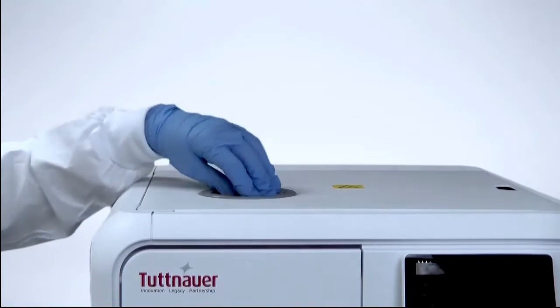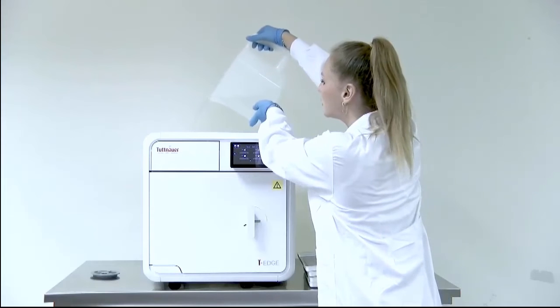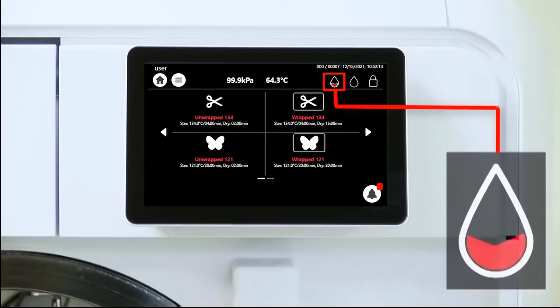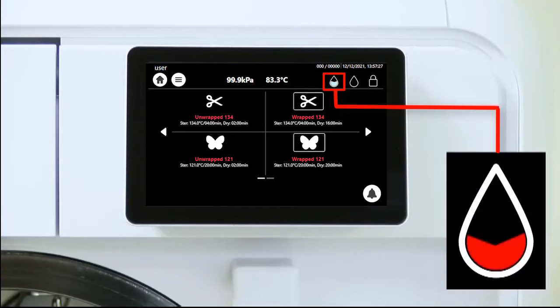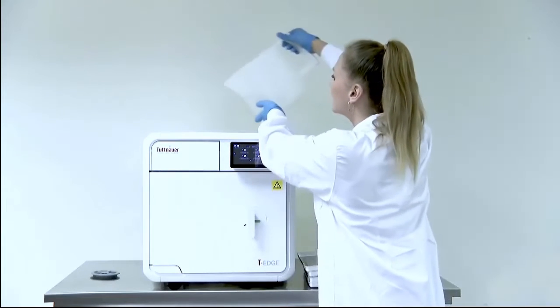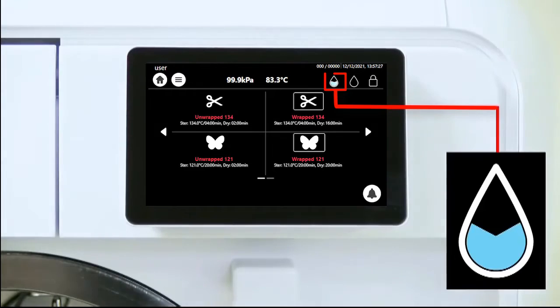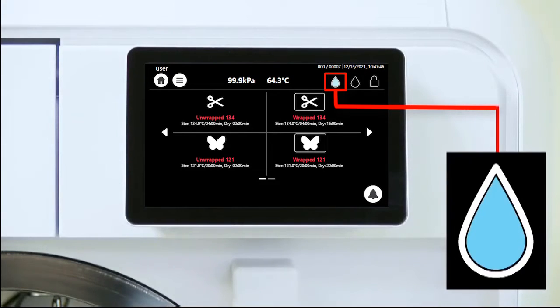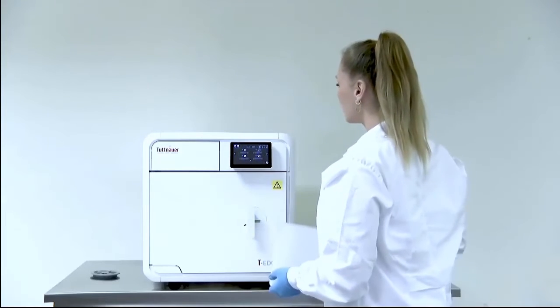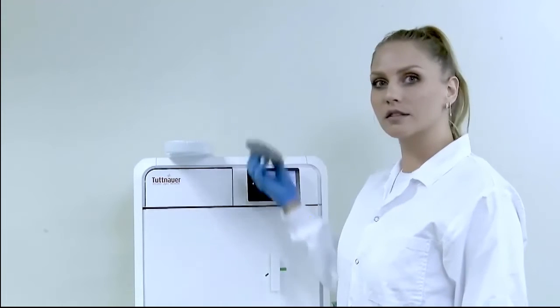Remove the cover from the water reservoir opening, then pour distilled water into the water tank. Watch for the water level indication icon to turn blue. Keep pouring distilled water until the icon indicates a full tank. If needed, use the water pouring extension aid to reach the water reservoir.